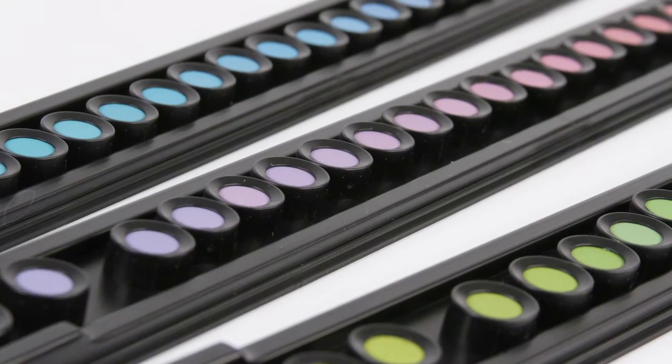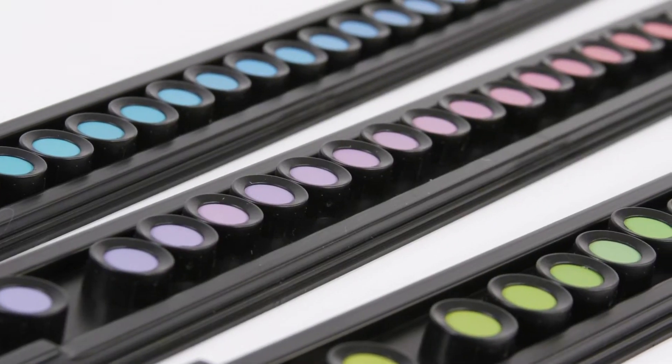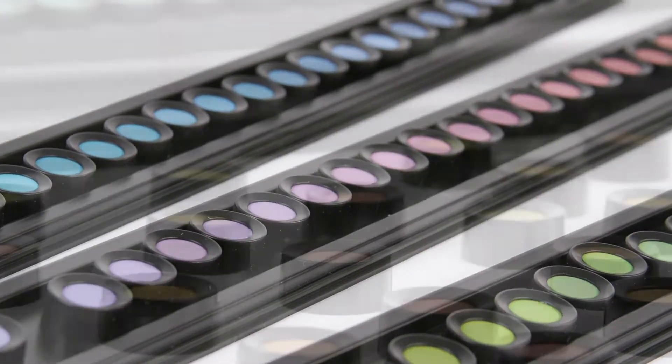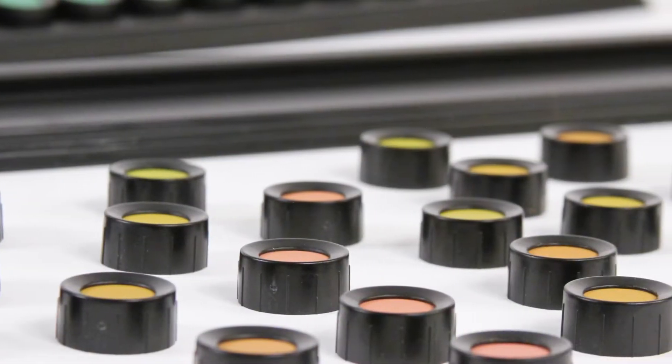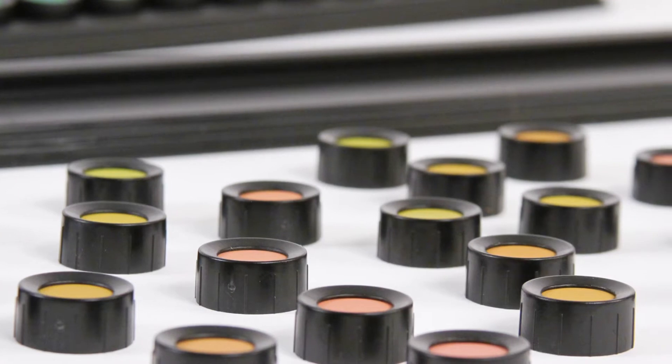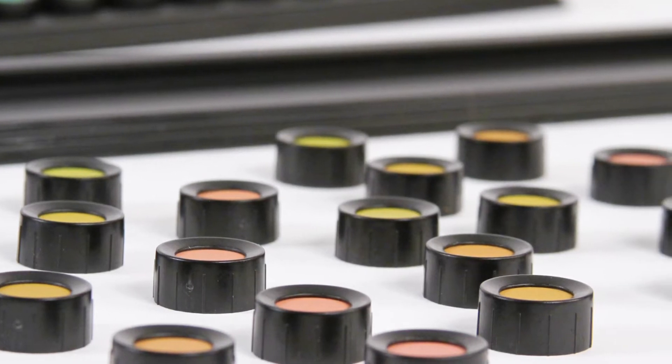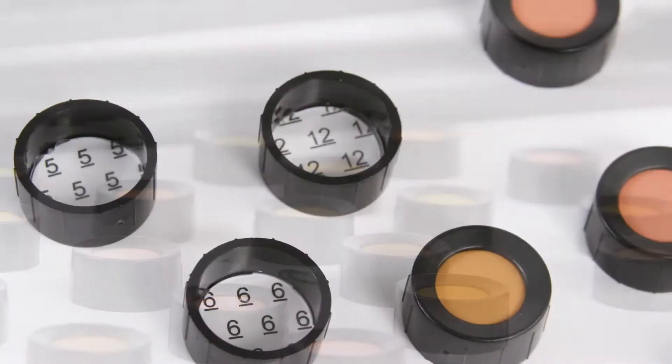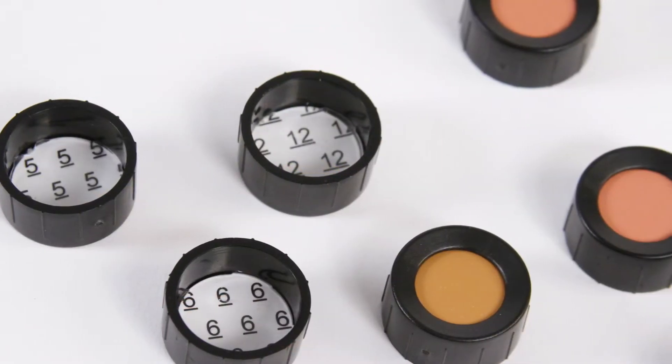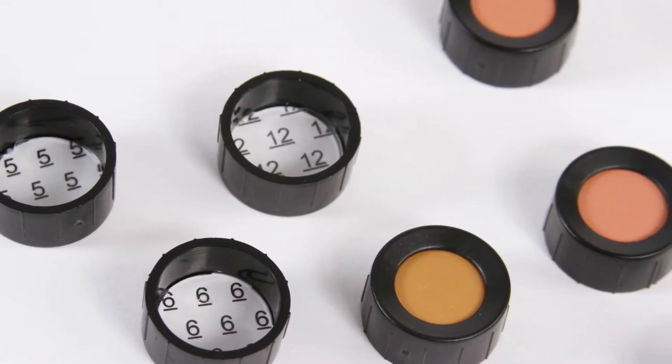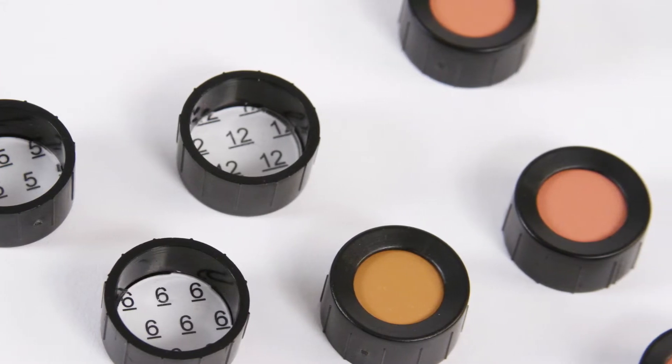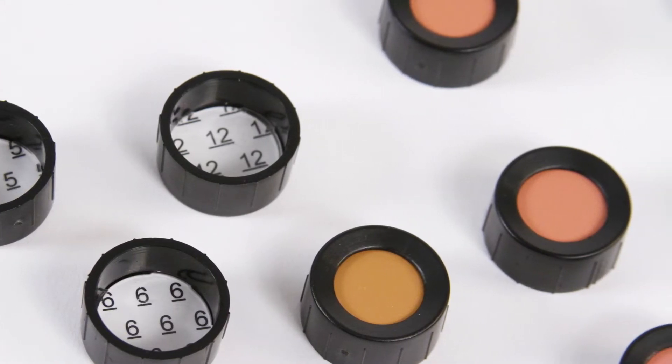For over 60 years, the Farnsworth Munsell 100 Hue Test or FM100 Hue Test has been the standard for testing color discrimination and is capable of showing a person's strengths and weaknesses for evaluating color.